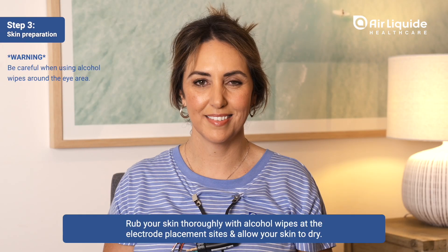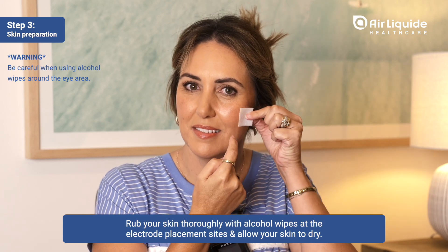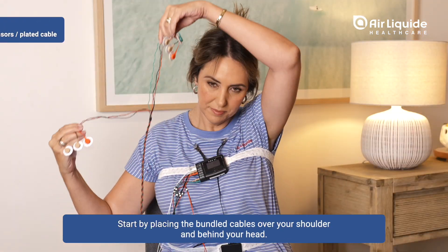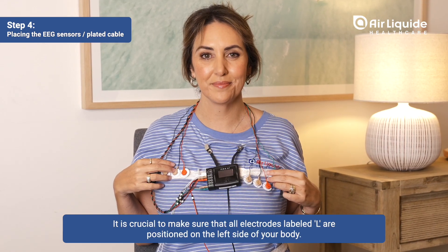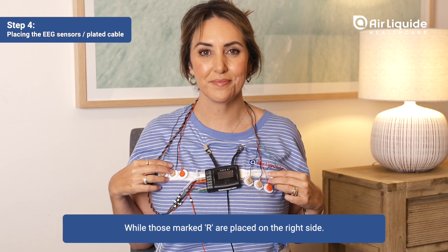Rub your skin thoroughly with alcohol wipes at the electrode placement sites and allow your skin to dry. The final two electrode sites to clean are located just under your collarbone — be sure to clean both sides. Start by placing the bundled cables over your shoulder and behind your head. It is crucial to make sure that all electrodes labelled L are positioned on the left side of your body, while those marked R are placed on the right side.